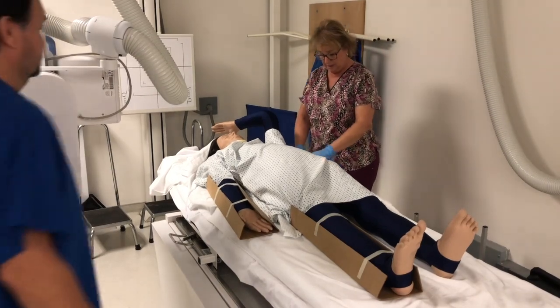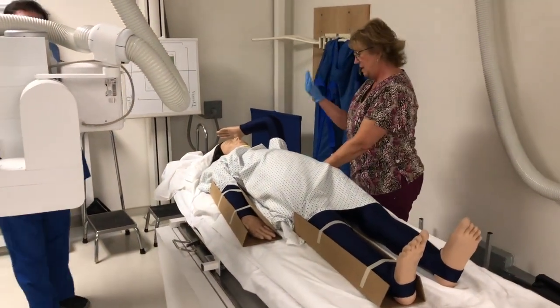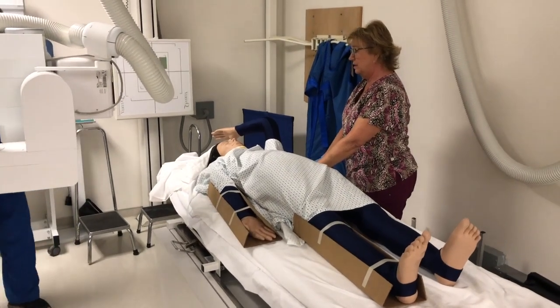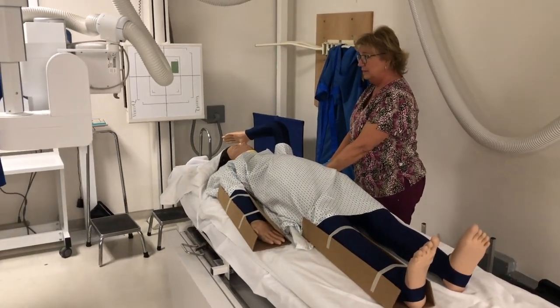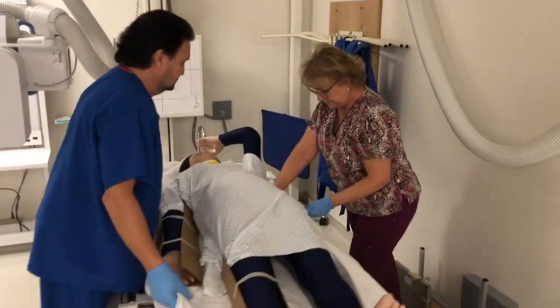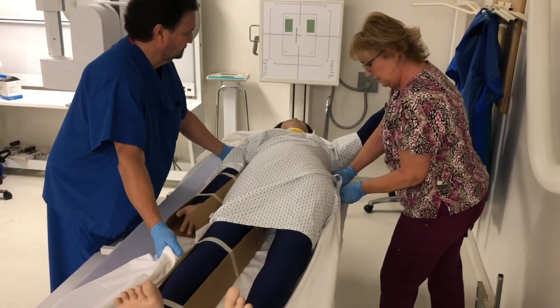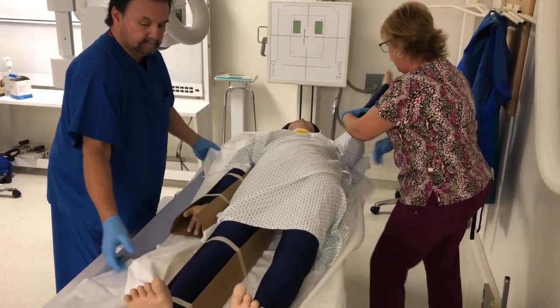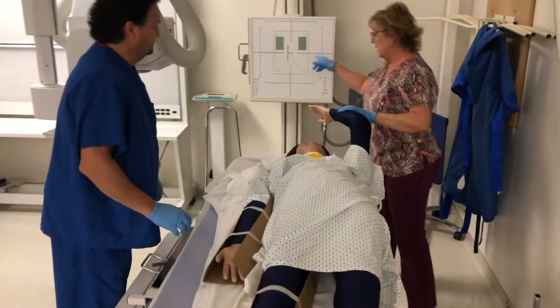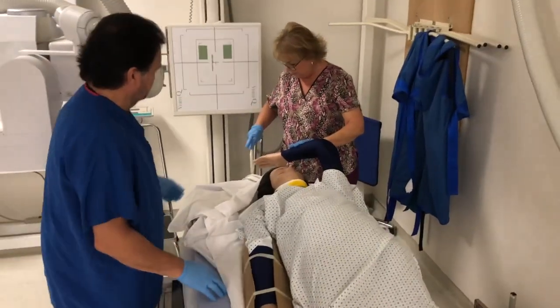All right, so we're gonna slide the patient over to this edge of the board. I'm gonna get her all the way to the edge. Whoops. Okay. Now this can also be done on the gurney against an upright wall bucky.